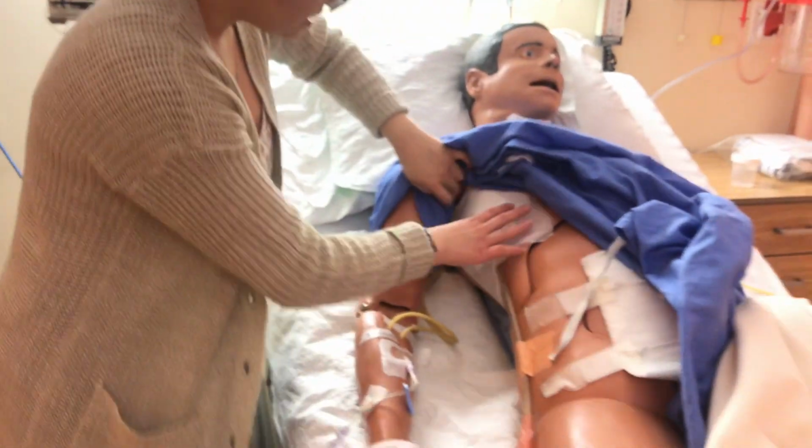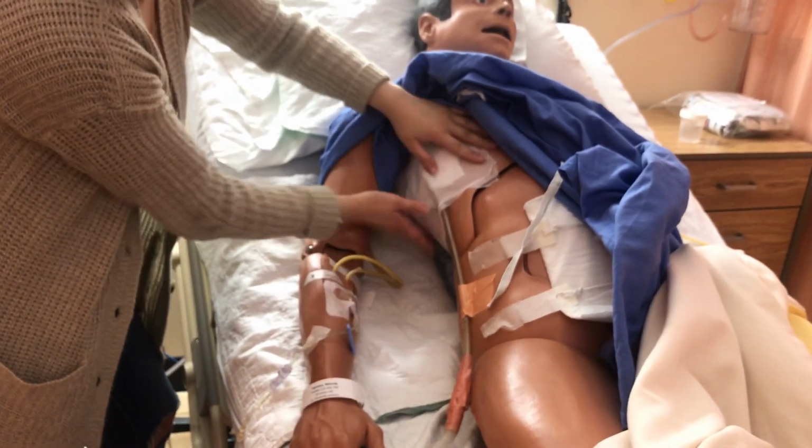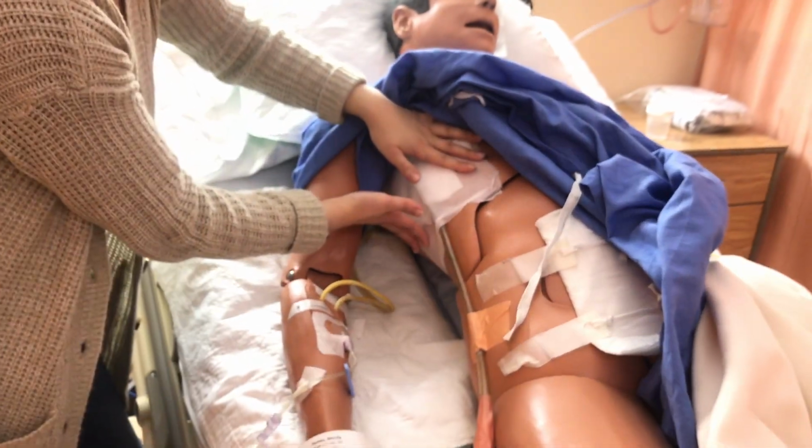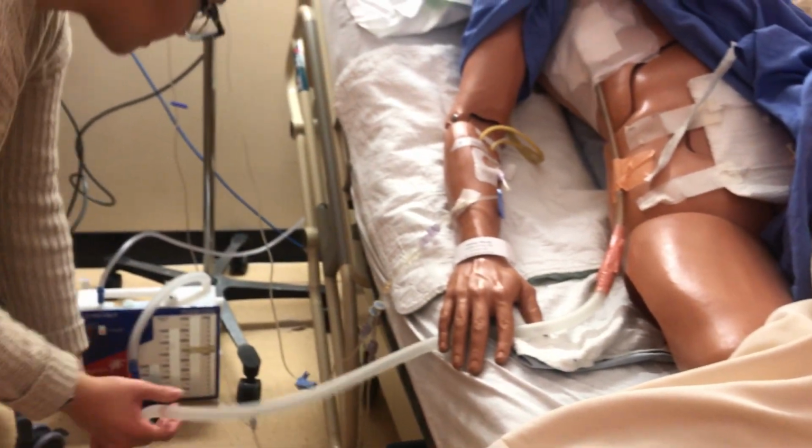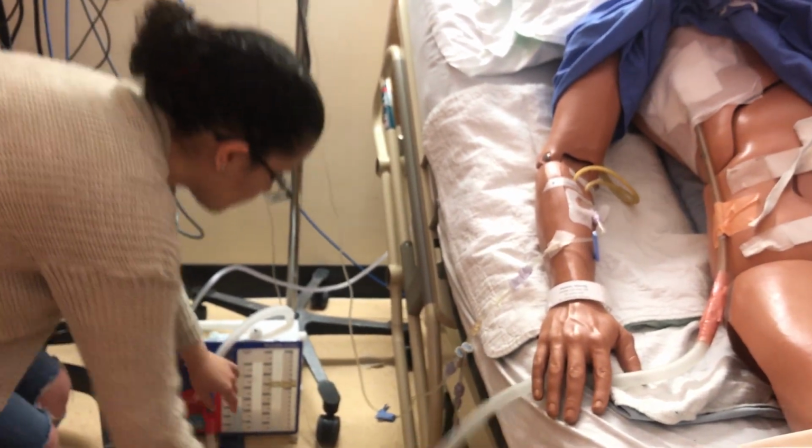And while I'm here, I'm going to see that the dressing is intact. I'm going to palpate and make sure I don't feel any subcutaneous emphysema. Again, I see no kinks, and it looks like we are good to go.